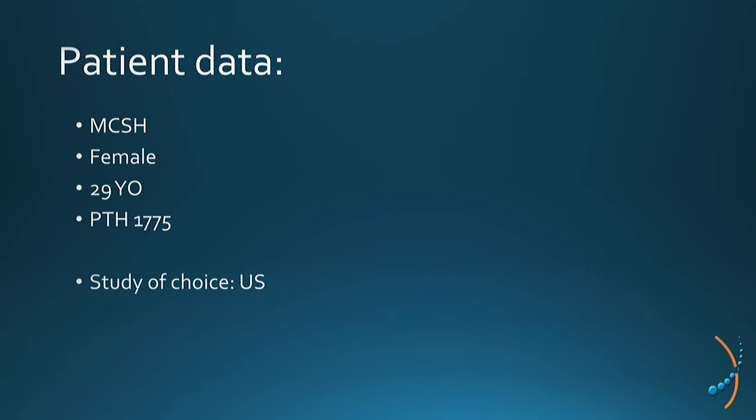My case is about a 29 years old female patient who came with an ultrasound request, to present a laboratory result with parathyroid hormone greater than 1000. A parathyroid tumor is suspected in this patient, so the study of choice is ultrasound.